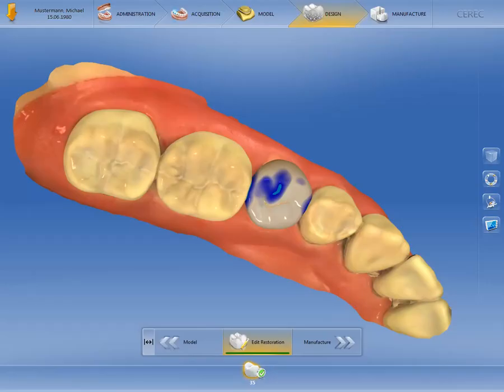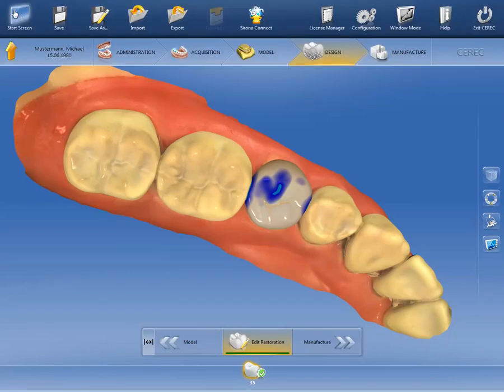We are in the design phase of a single tooth restoration and will first look at where the global restoration parameters can be found. Click on the orange-colored arrow at the top left to open the system menu. Next, click on Configuration and select the Parameters option.